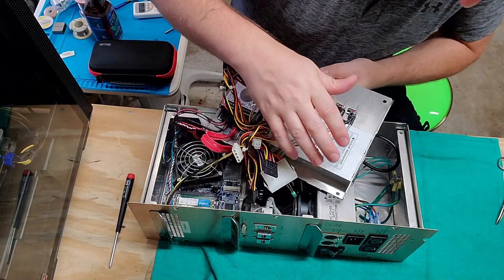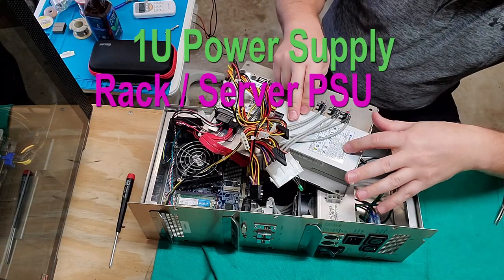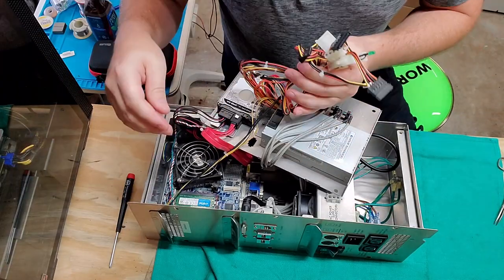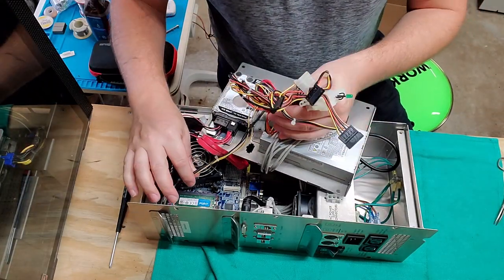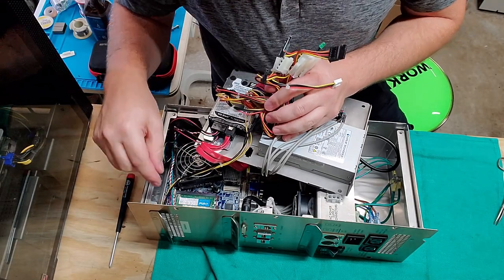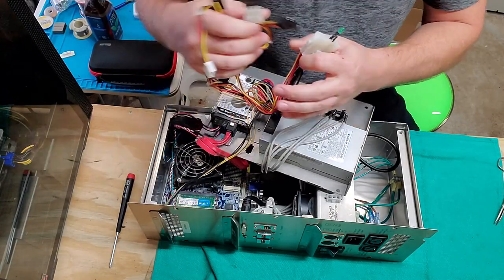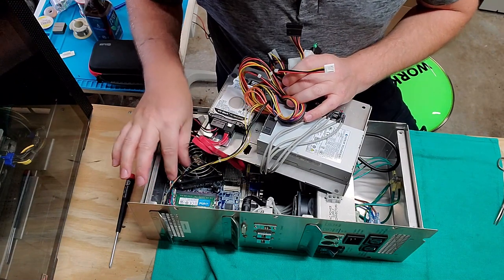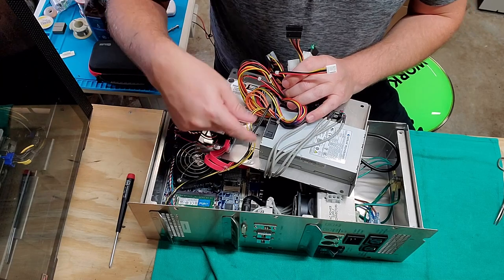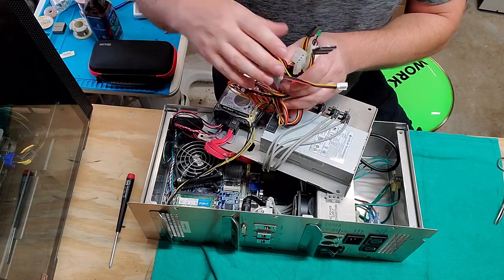So I have got a 1U form factor power supply. And, oh, wow, look at what's going on here. Okay, so this one right here is going to be your 12 volt, which goes down into the little motherboard. That's very interesting. So all these are just useless. They're just sitting in there. But we got one 12 volt rail, or two 12 volt rails that are going down into the motherboard along with ground. So two yellow, two black. And that's pretty much it from what I see.